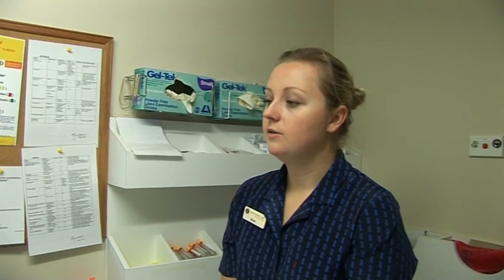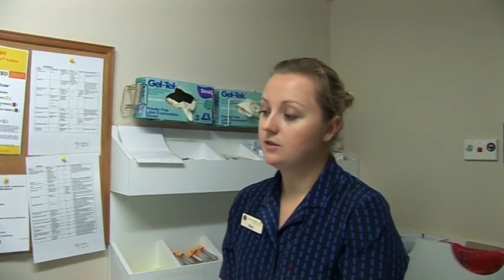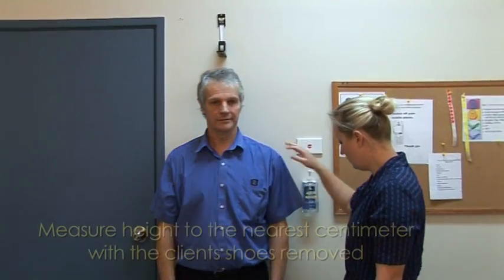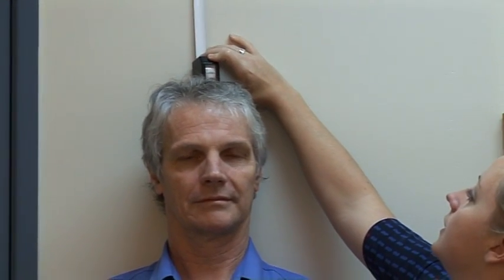Before we get started, I'll need to obtain your height and weight. I'll need to get you to remove everything heavy from your pockets, take your shoes off and step onto the scales for me. Okay, the first thing I need to get you to do is just standing flat against the wall with your heels up against it. Fantastic. Looking straight ahead. Okay, 182. Fantastic.